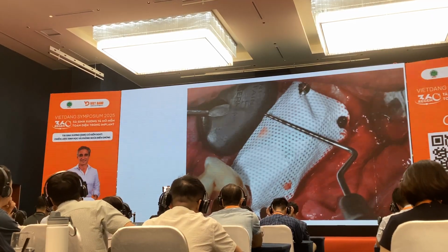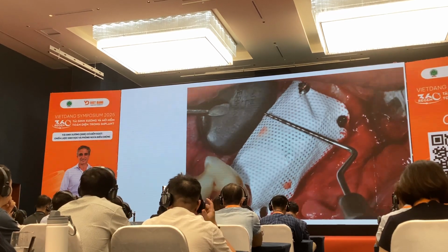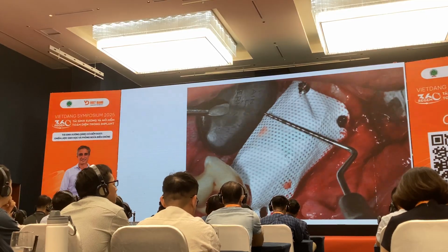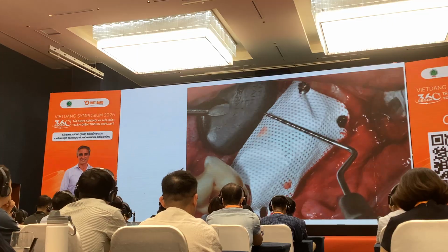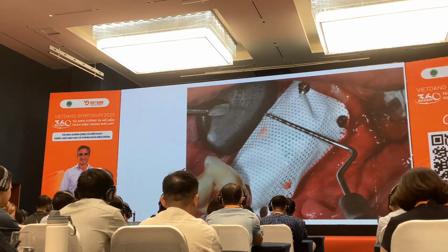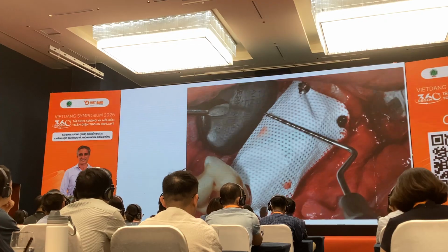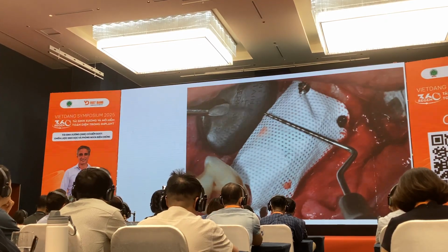But when we use the non-absorbable titanium-reinforced membrane, the periosteum is isolated. It cannot contribute to the regeneration of the bone. And what does that mean? You could say, but I managed to get the bone regeneration anyway.